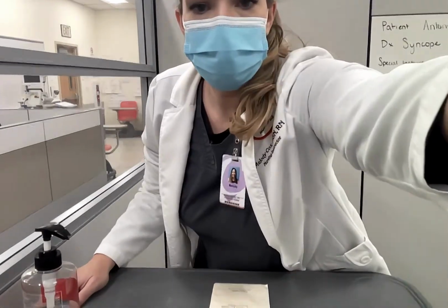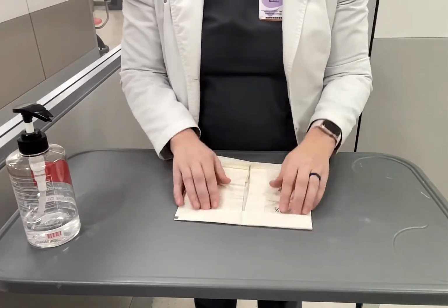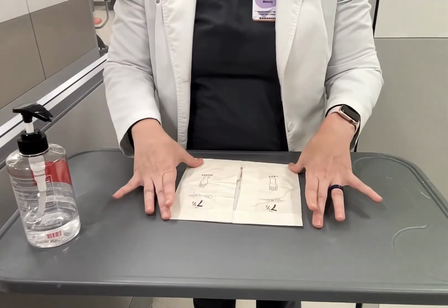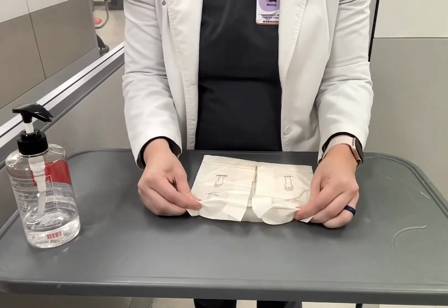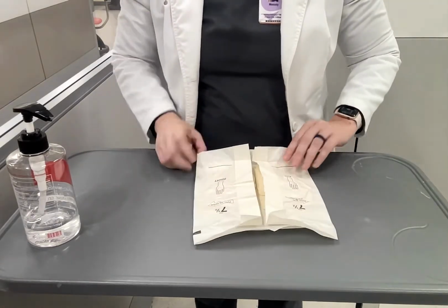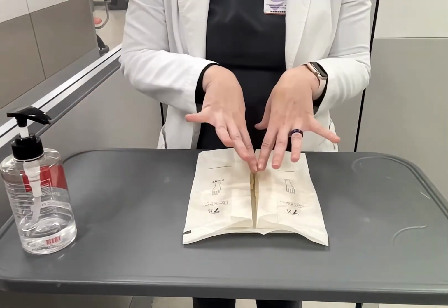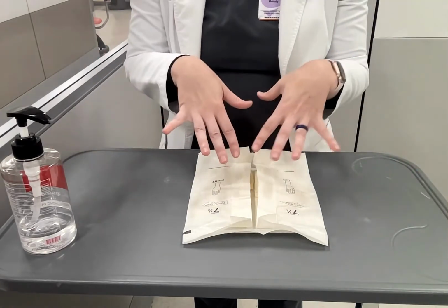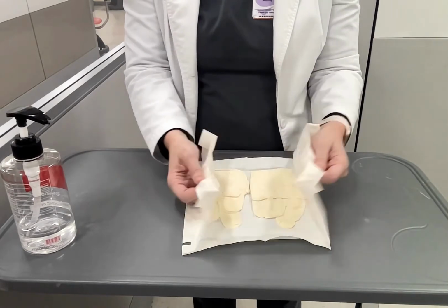All right, so now I'm going to show you my hands. I'm opening the package here. We are only allowed to touch the outer 1 inch. That's considered non-sterile. So as I'm opening this, this is the outside that's going to flip open onto the table, so I can touch the whole outside here. I'm trying to make sure that it doesn't fold back in on itself, because we don't want something that was previously open to be pulled back in. Whole outer 1 inch, I can fold it open.